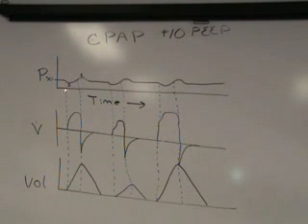If I take a look at the way that these things line up, the inspiratory flow pattern begins with a drop in pressure and ends with the increase in circuit pressure, which would be expiration. Down on my volume time scalar, I would see the volume going in during the beginning of the inspiration. Volume would continue to go into my patient until inspiration was done, signified here and here by my pressure and flow scalars, and then the volume comes back out.